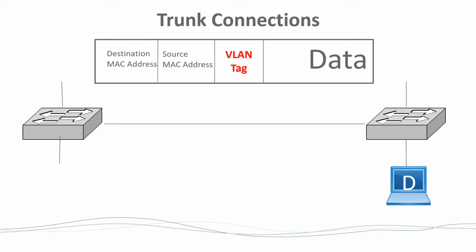So I can make a VLAN that's the biomedical device VLAN. And some of you probably have that, right? And I can propagate that VLAN out to access layer switches all over my hospital or all over my facility, right? And then I get on that switch, I can say just ports 2 and 3 are in the medical device VLAN. And then I can plug those into the ports that go to the room where I have the medical devices. So I can deliver that VLAN all over the place.